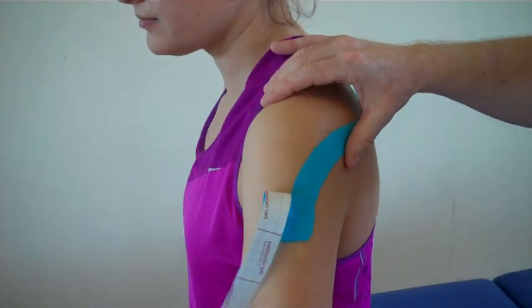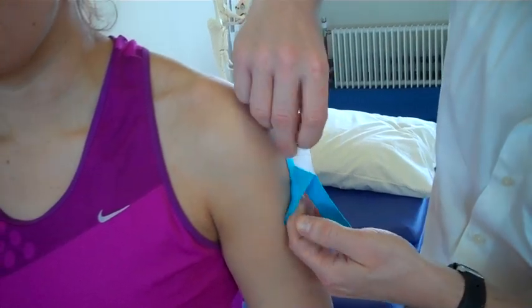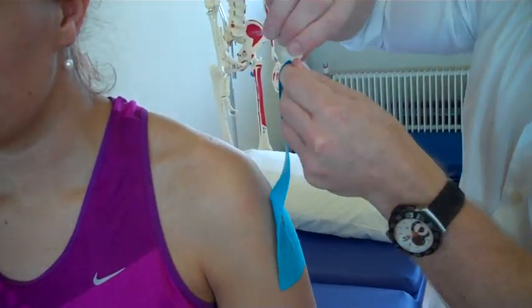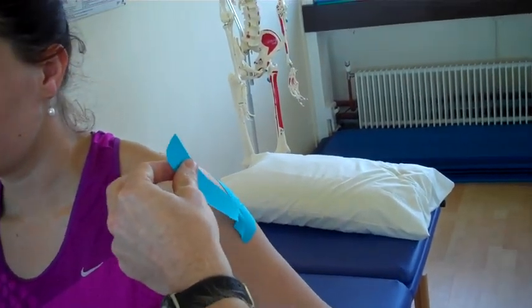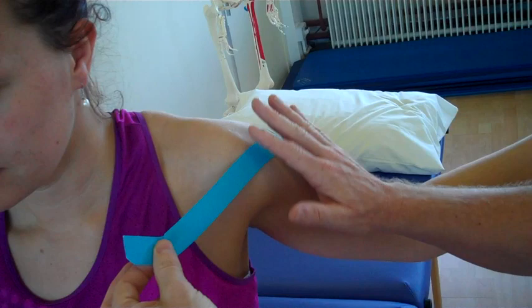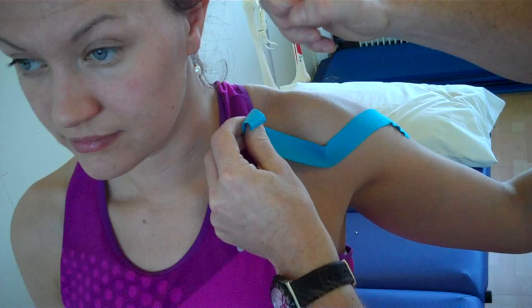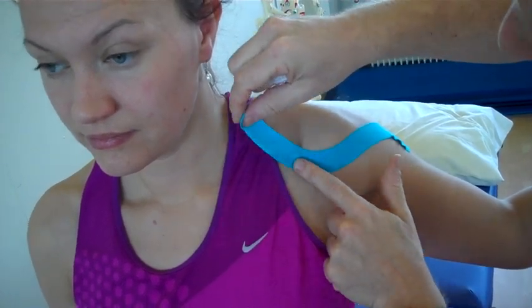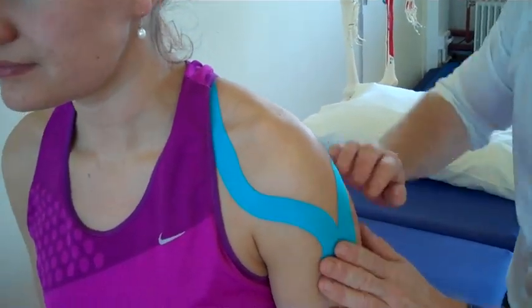To do the anterior aspect, we're going to take off part of the tape and feed that back. We're going to place the anterior fibers on stretch, so we bring the arm back — if the patient is able to with a rotator cuff — so we're in our position there. With no stretch, we mould that around and feed this under so we can mould it around. This is just going to tuck under the top and then relax the arm down. That's applying the first bit, which is used for generalised taping for the shoulder.